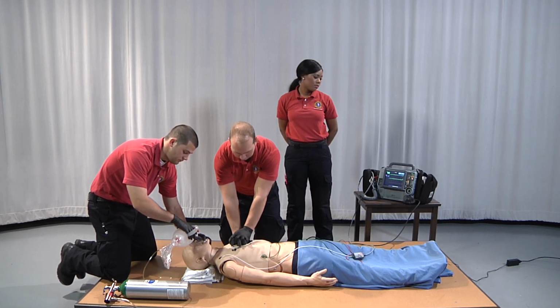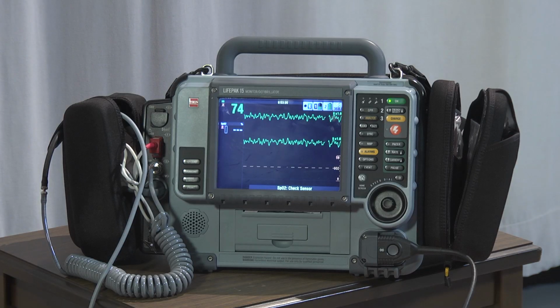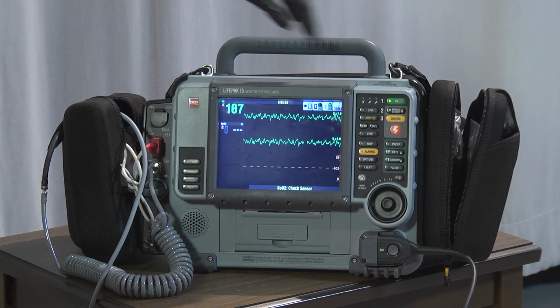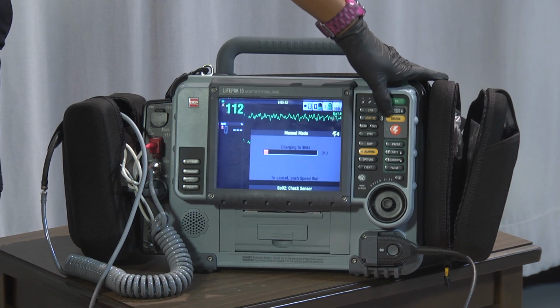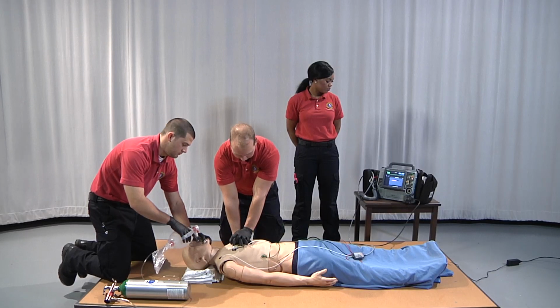At the appropriate time, stop CPR and observe rhythm. If rhythm is shockable, charge to the manufacturer's suggested setting or what has been implemented by your medical director. It is important for the EMSP to ensure compressions are continued while the monitor charges.